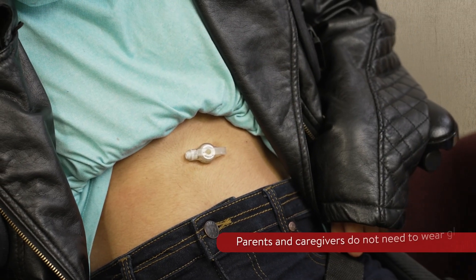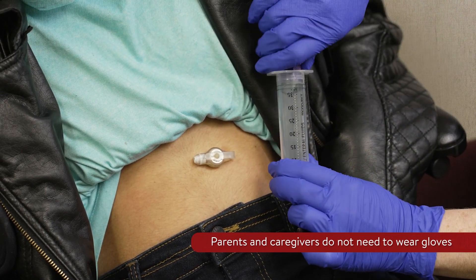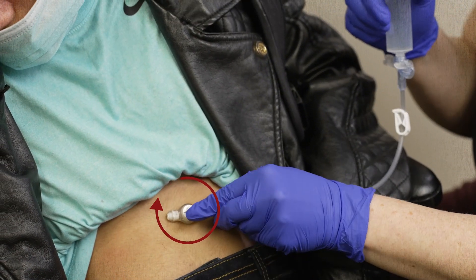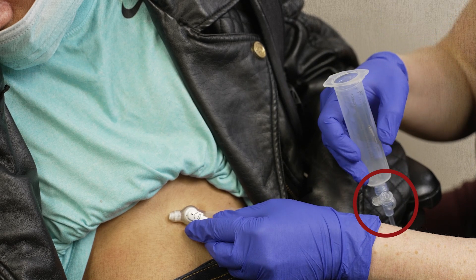To vent or release air from your child's G-tube, have your child lie down on their back. Remove the plunger of the 35-milliliter or larger Enfit syringe. Connect and lock in the extension set to the G-tube, then attach the syringe to the end of the extension without the plunger or stopper.